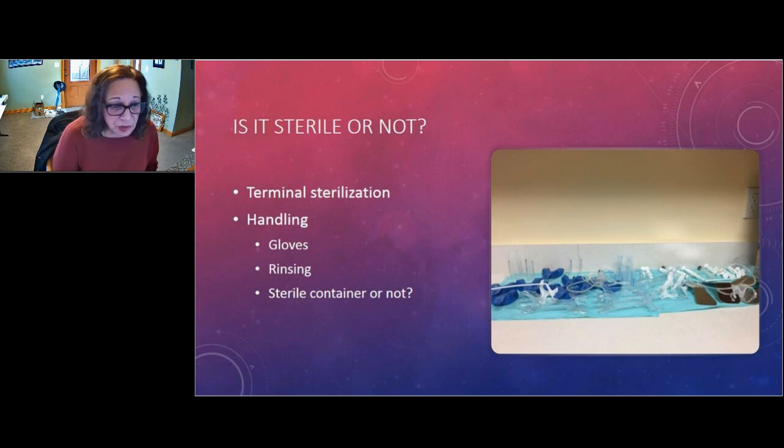So are you using sterile gloves? Are you using sterile water? Are you putting the item in a sterile container or not? Those all will come into play in whether or not the item is contaminated once it has been through this process. So handling after the soak process is extremely important. You want to make sure you're not recontaminating the items once you've soaked them.